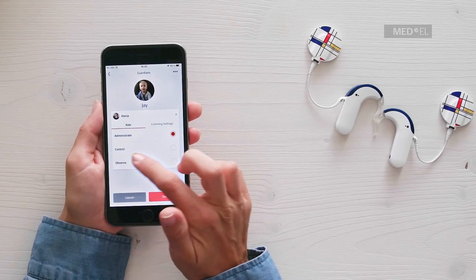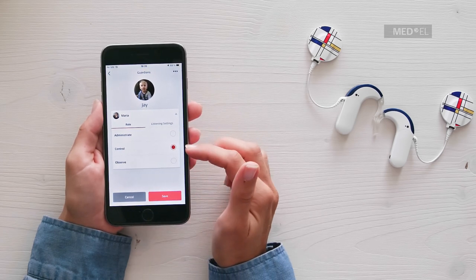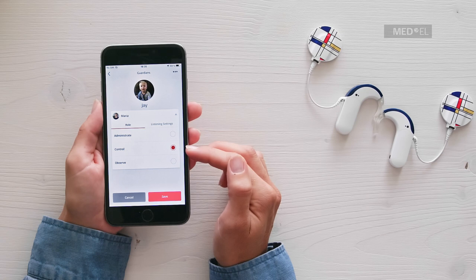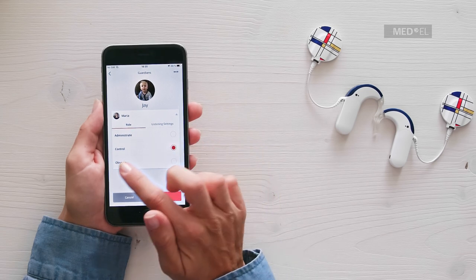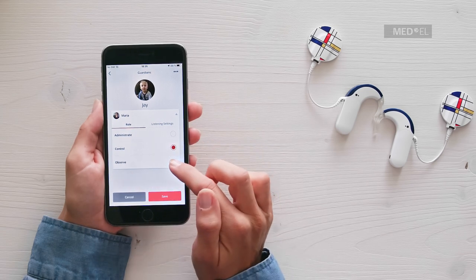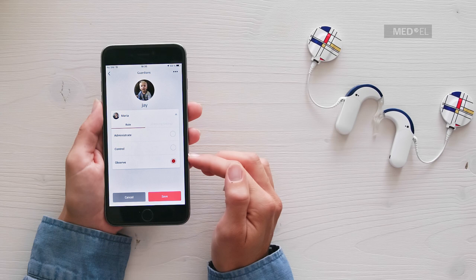If you have the Control Guardian role, you can change the user's listening settings and view their hearing stats. If you are a teacher or part-time caregiver and regularly need to change settings on a user's audio processor, this is the role for you. With the Observe guardian role, you can only see the hearing stats of the user.